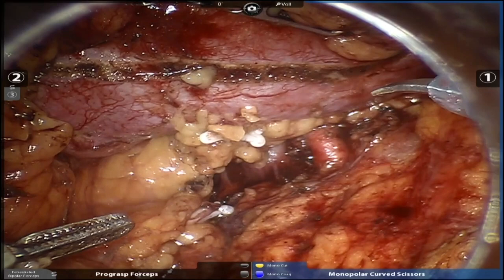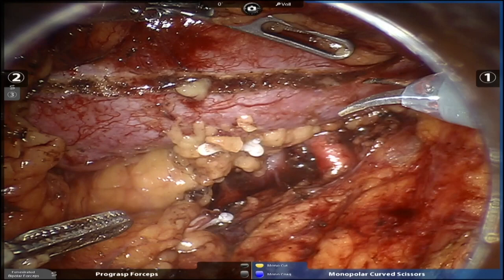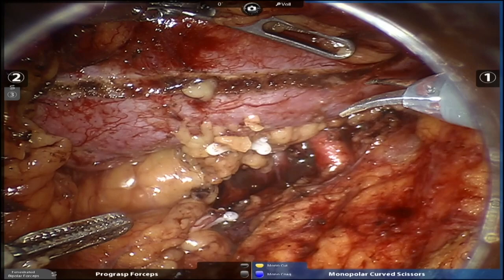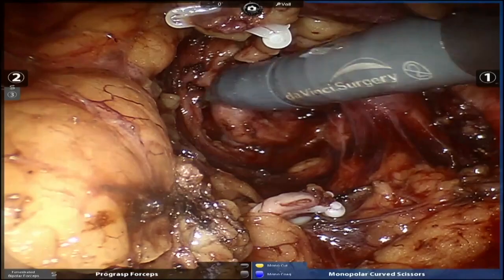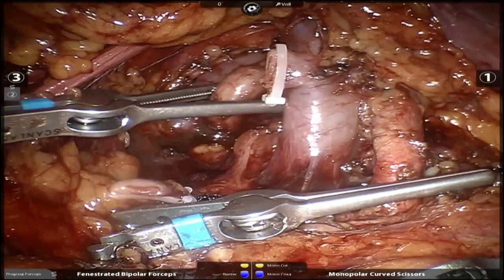Okay, all right, three bulldogs and a bolster. We're going to cut three bulldogs and a bolster, okay? I'm going to clamp those vessels, and then if it is, it is. If it's not, we're not going to hurt anything. Right, I think that's a good plan. Indy's got a good plan here. All right, so I don't know what that is, but we're definitely going to clamp it.